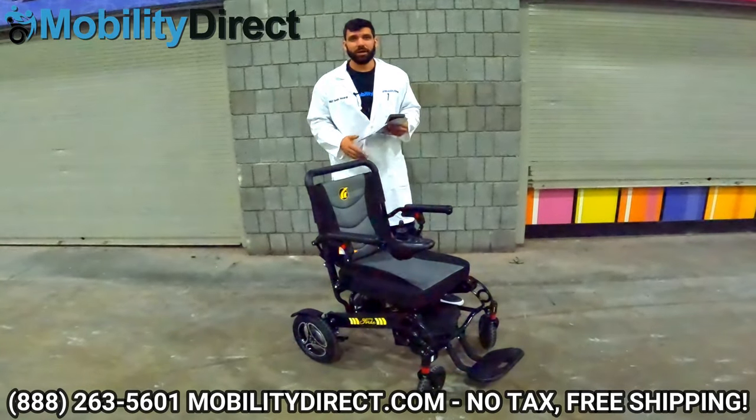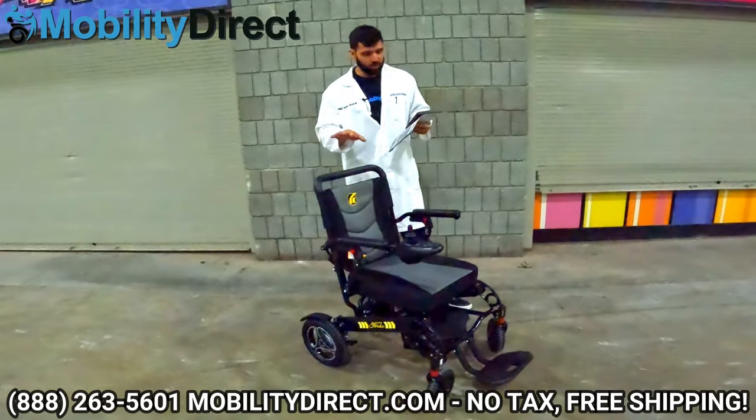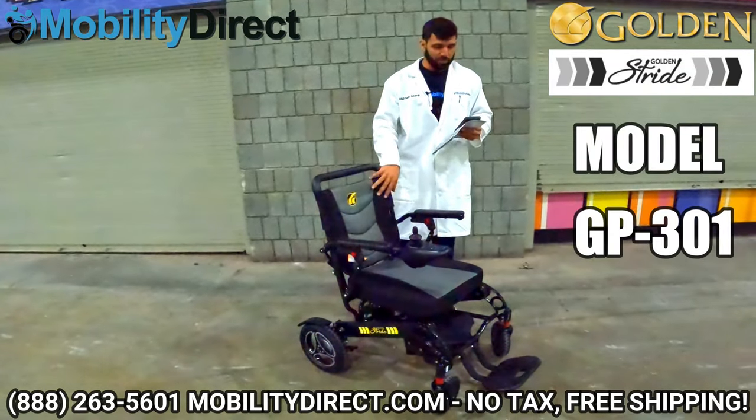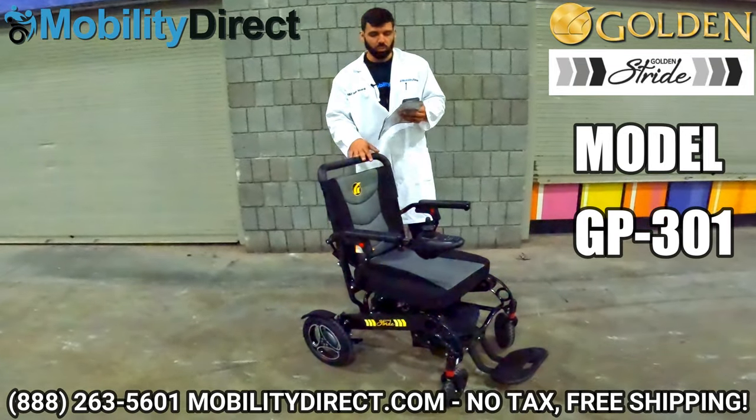Hi everybody, I'm Sergio with Mobility Direct and welcome to our YouTube channel. In today's video, we're going to give you a review of the Golden Technologies Stride Folding Power Wheelchair, also known as model number GP301.